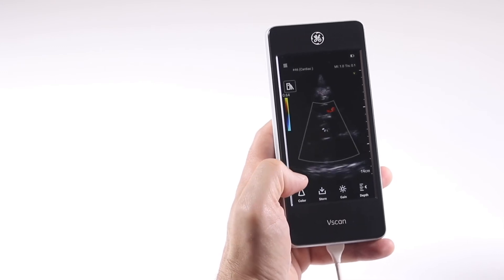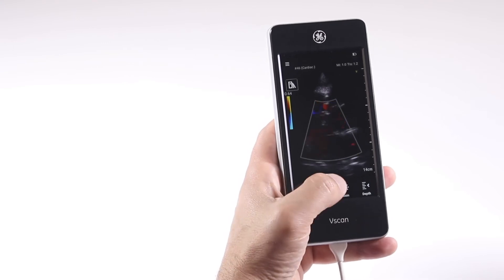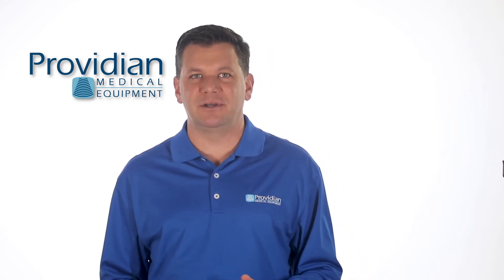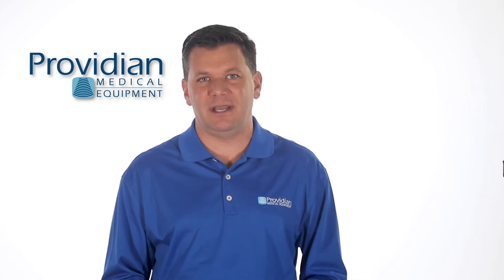A few of the more popular apps include a bladder volume app with automatic suggestions for catheter replacement, a lung protocol, a scan coach app that provides a protocol of standard ultrasound views and reference materials, and Elvivo-EF, which is an auto-ejection fraction calculation.